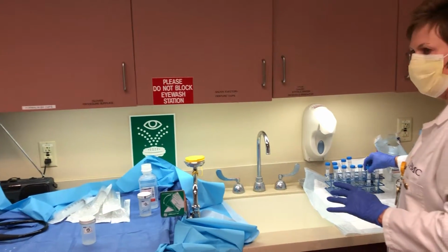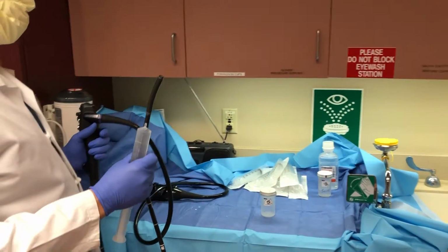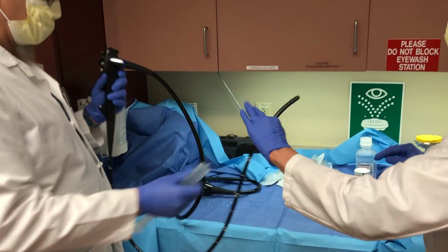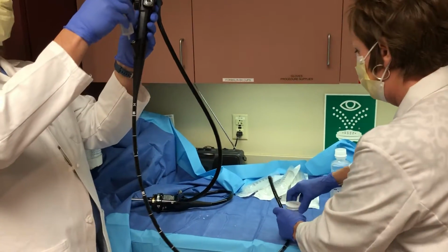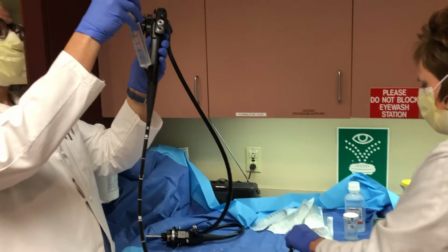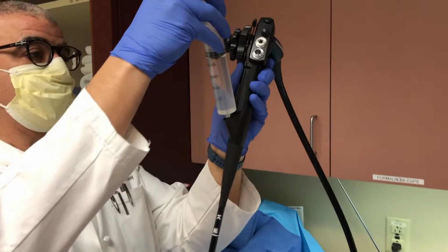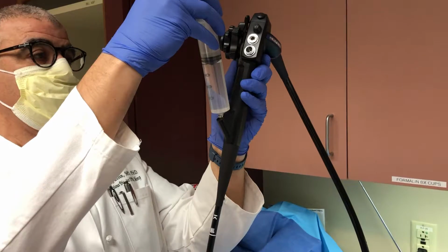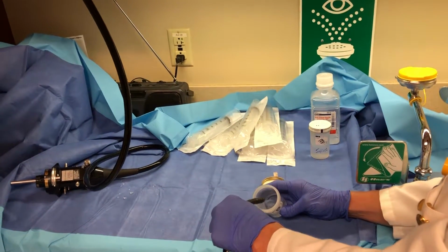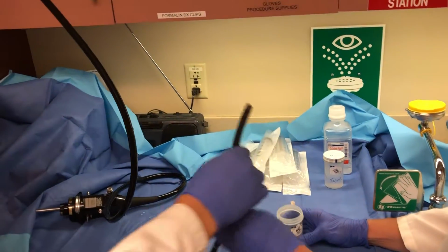So now we're on specimen number 5. It helps to uncap things and loosen them ahead of time. So we're on this particular scope, number 5, and we've already checked the serial number to correlate with this specimen number 5. Dr. Yassine is going to flush half of the 60 cc syringe of sterile saline, and I'm capturing the diluent into this sterile cup.